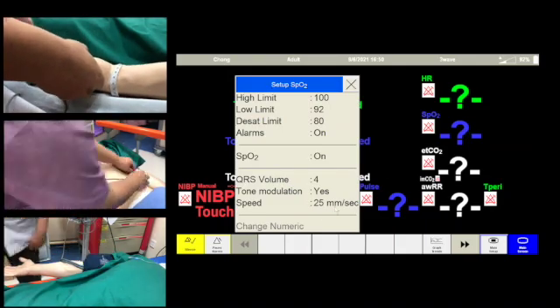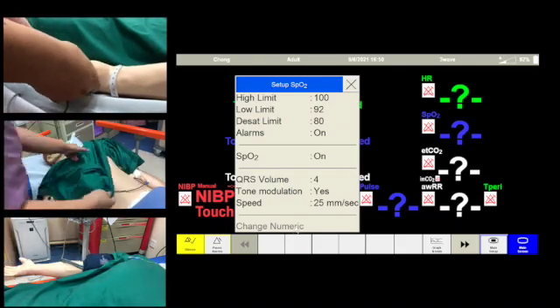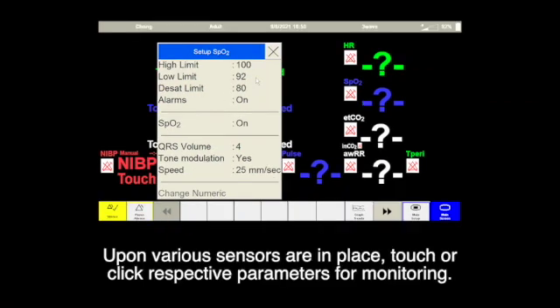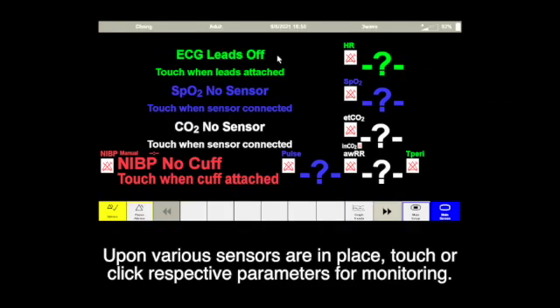Upon various sensors being in place, touch or click the respective parameters for monitoring.